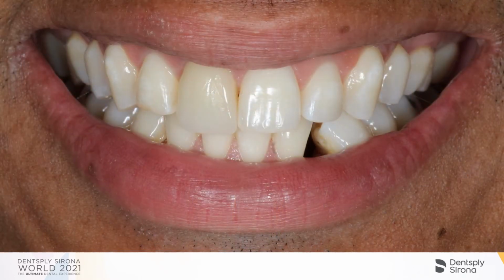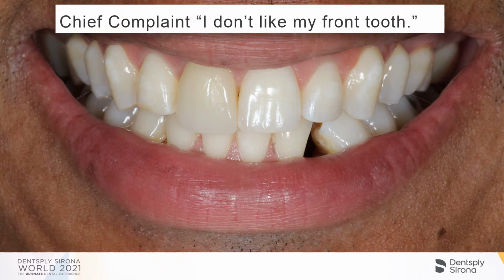So even though the first thing that draws my attention on this screen is the diastema or space on the lower left-hand side, the patient's chief complaint is, "I don't like my front tooth." Okay, so let's go ahead and start from here.